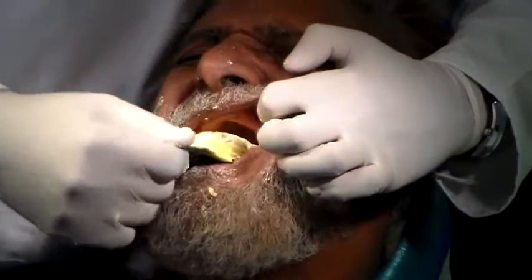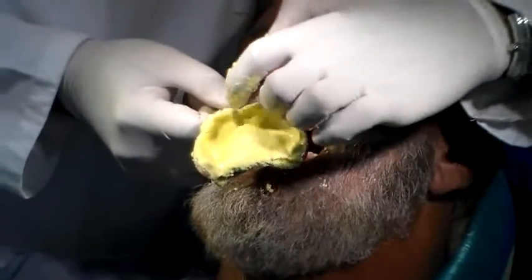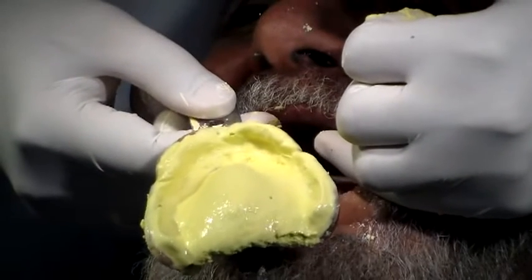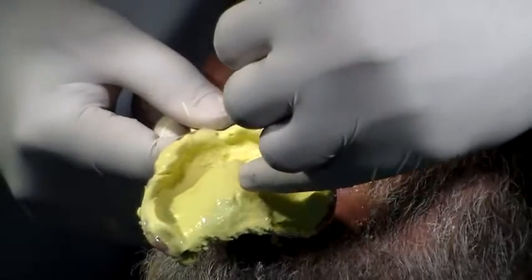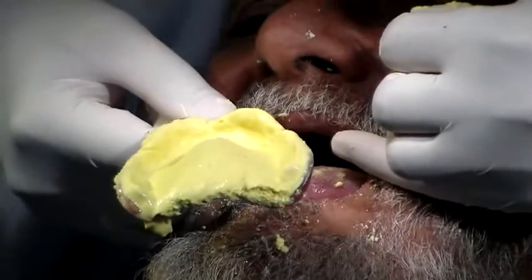So you want to just break the seal and take it off, and there's your impression. As you can see, it's okay — all the vestibules are recorded, the frenums are recorded. You have slight denudation of the impression material in the rugae area, but that's common because of the fibrous nature of the rugae. You also have the fovea palatini in this region, so you know where your fovea palatini line is going to come.